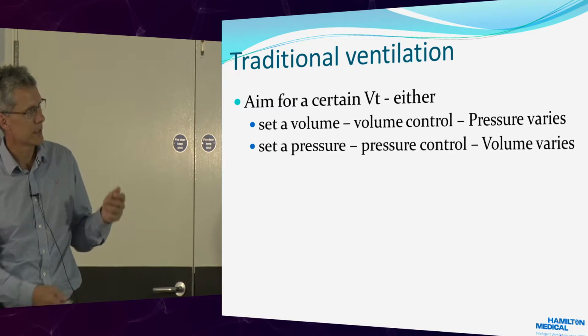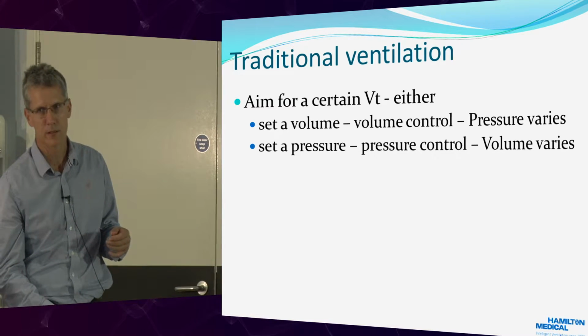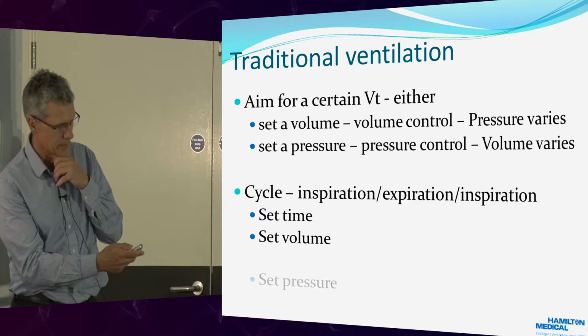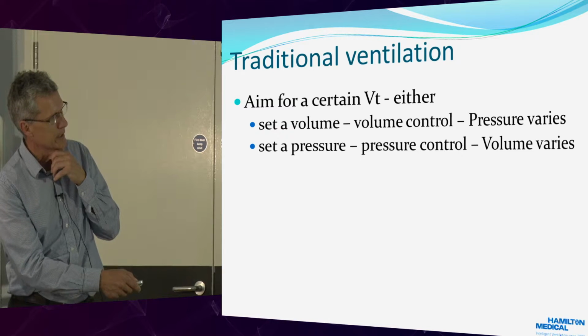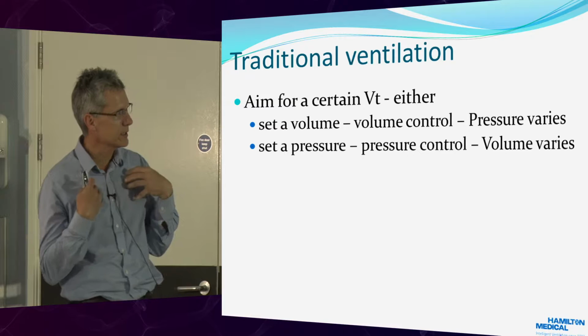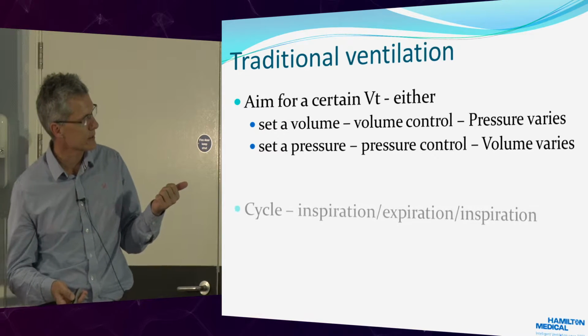The States use this a lot. Canada, all the trials there, they're very volume focused. The UK is a little bit more pressure focused, where you set a pressure and the volume varies. I personally think this is a potential problem, and I'll go through why I think this in a bit.